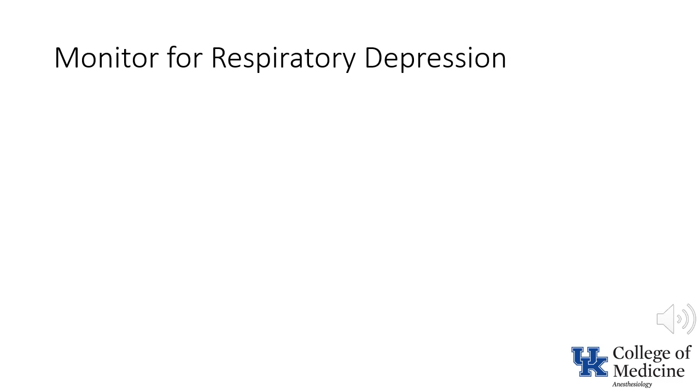Prior to the widespread acceptance of the accuracy of capnometry in spontaneously breathing, unintubated patients, attempts were made to use pulse oximetry as an indicator of respiratory depression. It was advocated for patients who were undergoing procedural sedation from nurses or physicians without anesthesia experience, for example, during colonoscopy. It was also advocated to monitor patients receiving neuraxial opioids on the floor.